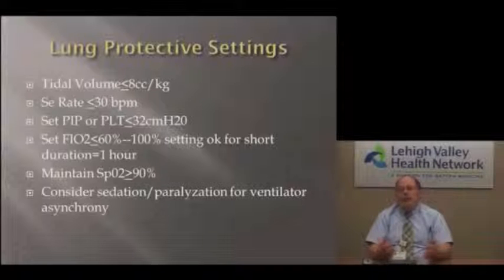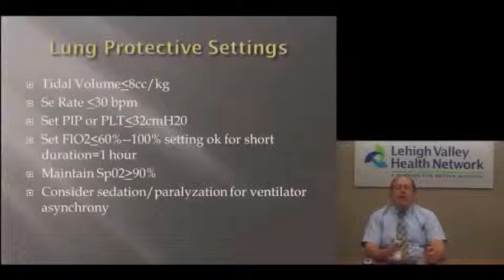100% is okay for short periods of time, but you don't like to keep patients on 100% for long periods of time. Everybody knows about oxygen toxicity. The other thing, though, is you can get what's known as absorption atelectasis. If you have 100% gas, you can denitrogenate the alveoli and cause collapse. So if you don't need 100%, and again, that's why I put down maintain sat of 90%. It used to be that we wanted everybody to have a sat of 100%. We really don't need that unless the patient has other comorbidities. If the patient has a major head injury or a major myocardial infarction, then you may want to set a sat of 100% because those organs are very vulnerable.